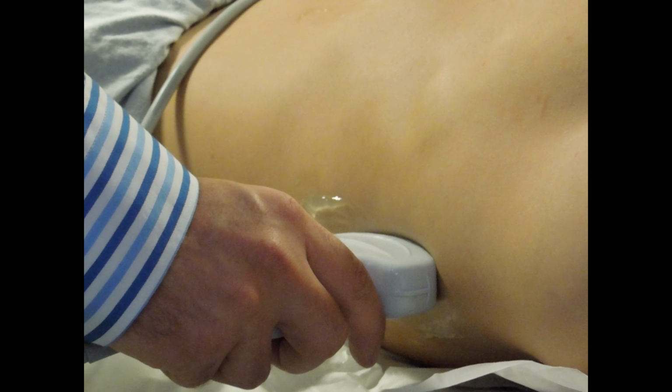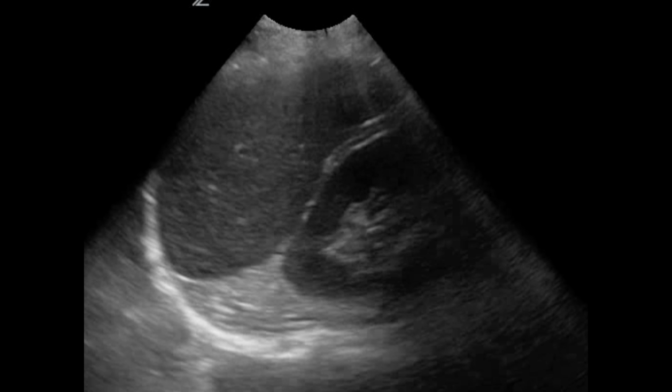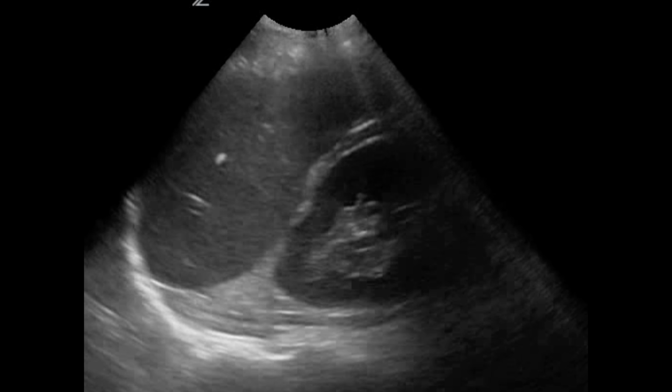Here's your motion, this nice sliding up and down, again comfortably holding the probe to slide right up and down, and this is the image you'll generate when you do that. You go through the entire three-dimensional structure. There's a nice picture at the beginning.